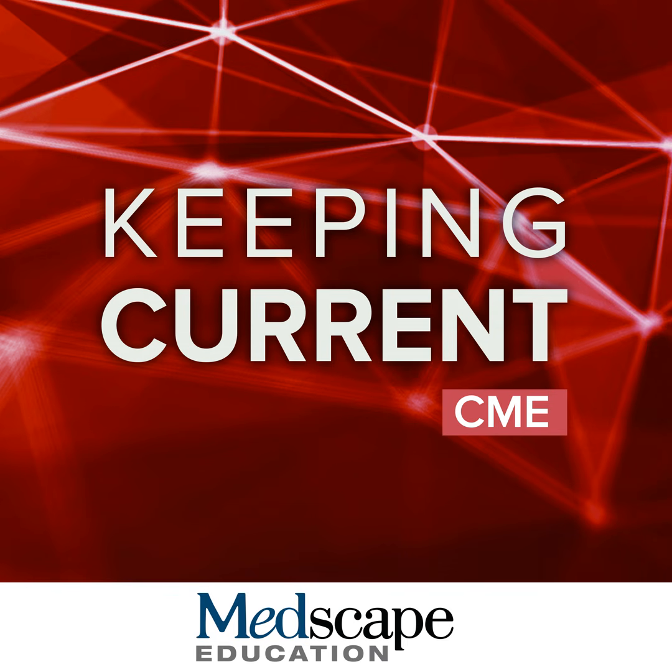In terms of software, there are actually now FDA cleared tools in the United States for performing this quantification. And this is now part of the standard software package that's available in most nuclear medicine departments. And this can actually really help aid in the context of the visual read. But again, the visual read is still considered that gold standard, and that's what the autopsy studies were aligned with. Centiloid quantification is, again, the standard scale. It goes from 0 to 100, and it uses an internal reference region, in this case, the cerebellum.